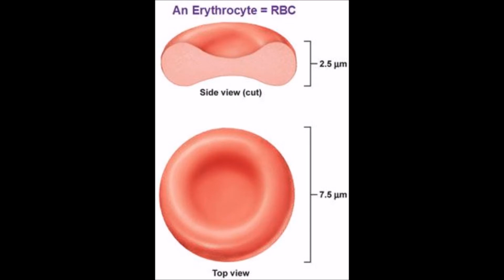So everybody, the normal erythrocyte, what it should look like, is very similar to this image here. It's essentially a disc, which is about 7 microns in length. The erythrocyte has a central pallor, which can be seen in the center of it, which is a biconcave part of the disc. The central pallor should take up about 1/3 of the whole surface area of the erythrocyte. So you can see the central pallor kind of dips in. It's where the nucleus of the cell has been pitted out through maturation processes. That's the concave part, so that's why the erythrocyte is considered to be a biconcave disc.